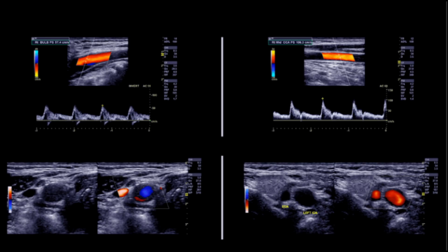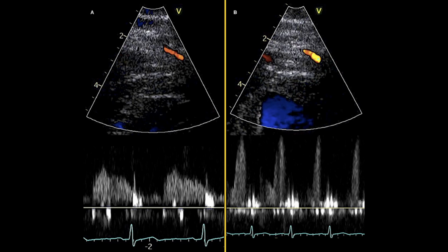All right, let's put on our detective hats and dive into the world of vascular ultrasounds, where we get to play Spot the Blockage. When we're looking at blood vessels, it's like we're on a mission to find any traffic jams, or, worse, blood clots. In arteries, we use Doppler. Think of it as the radar for blood flow.